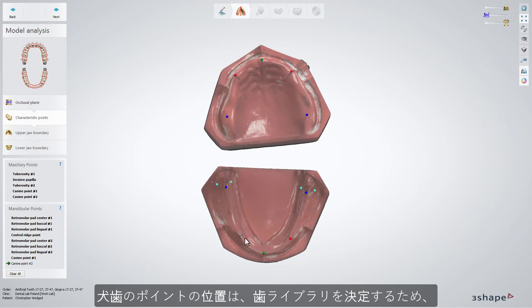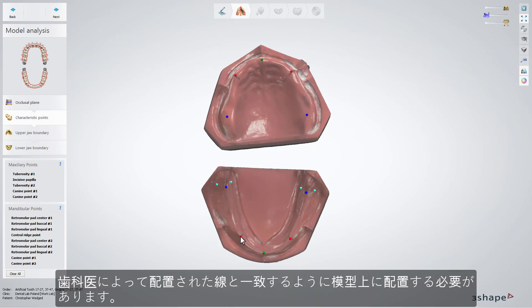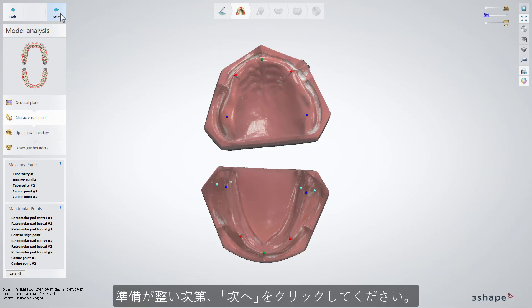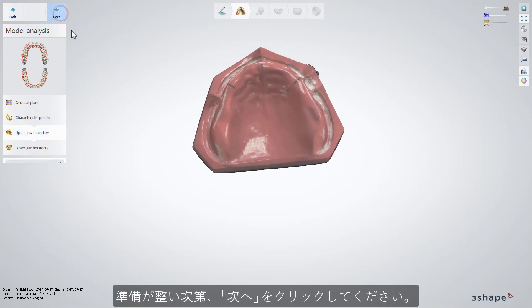The position of canine points determines the teeth library selection. Therefore, they should be placed on the model in such a way as to coincide with the lines arranged by the dentist. When you are ready, click Next.